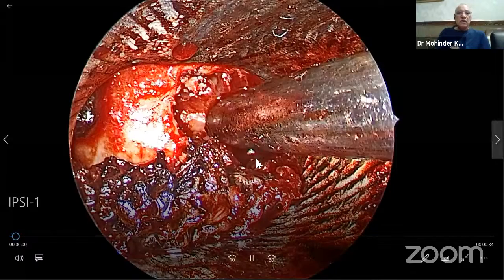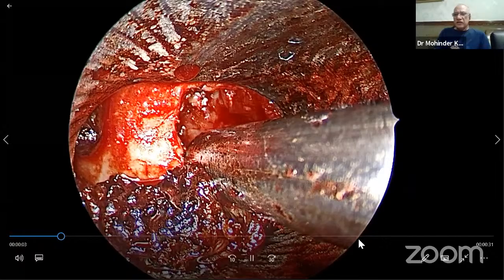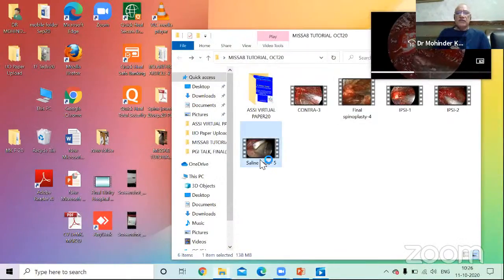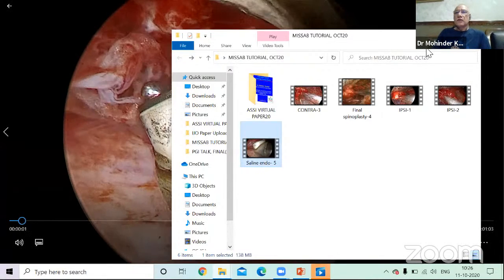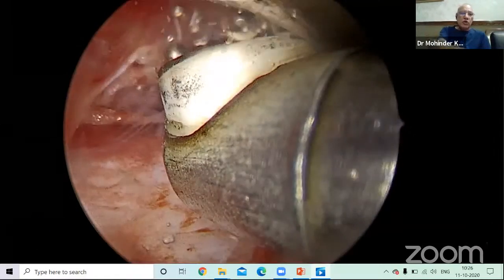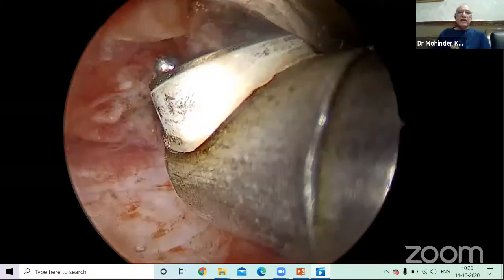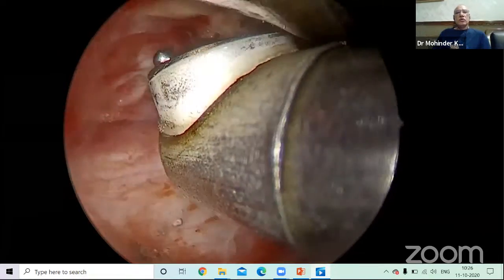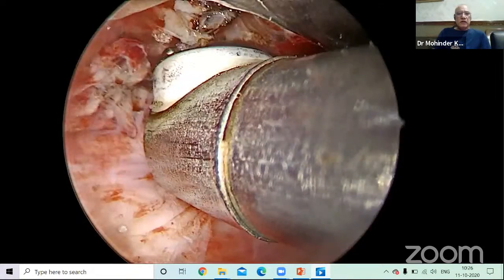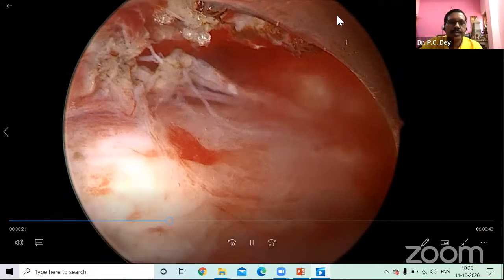Now this is a video which is showing the endoscopic laminotomy. I think I need not show this. And finally, I have switched over to fluid in the cervical spine. If you see, I'm using an RF to control the bleeding, and down below the cord is nicely decompressed. So in the end, switching over to saline endoscopy gives you a clearer view, and you can see inside in a better way. So I think I will stop my speech here now.